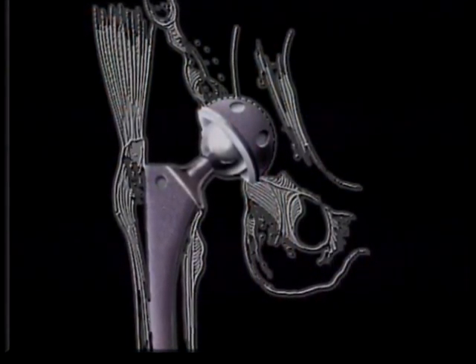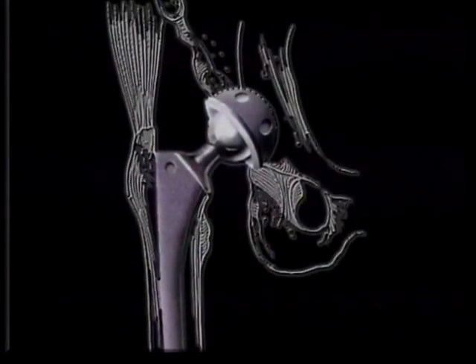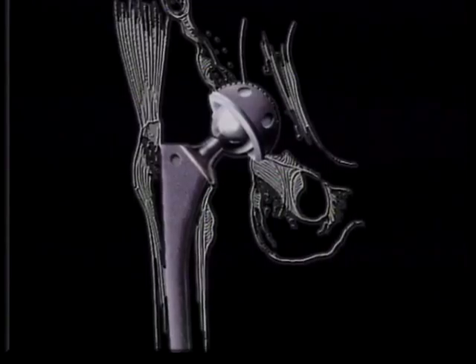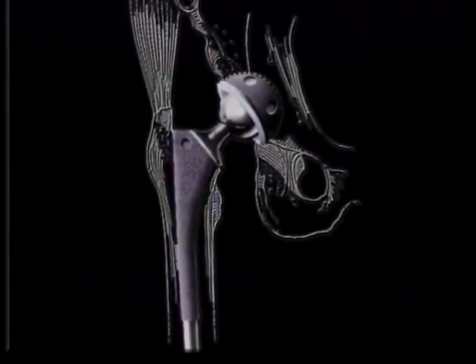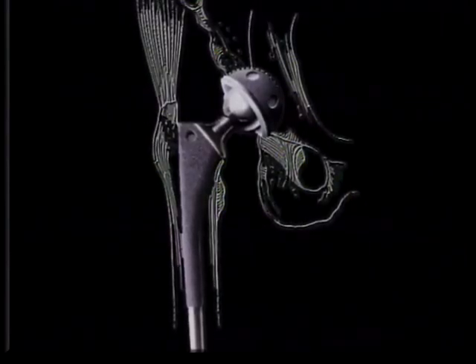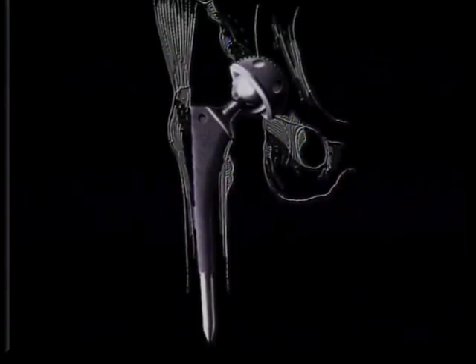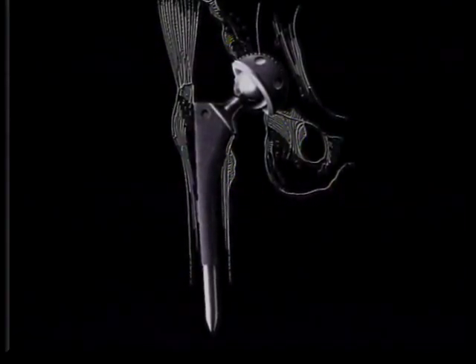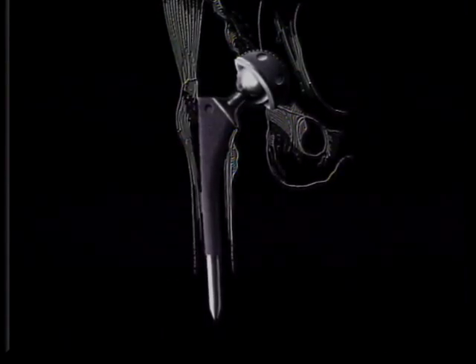This prosthesis is usually made of medical-grade plastic and is the bearing surface. Titanium or cobalt chromium alloy are metals commonly used in prostheses for joints in the body. The femur is then prepared for the metal stem and a smooth metal ball is attached. The ball is then placed in the plastic socket and the surgery is finished. A bone cement may be used for either or both stem and socket.